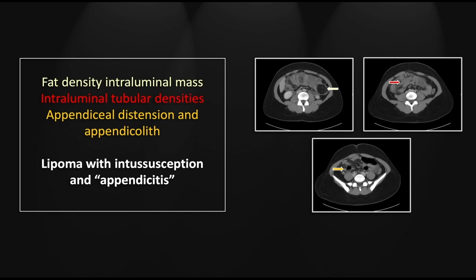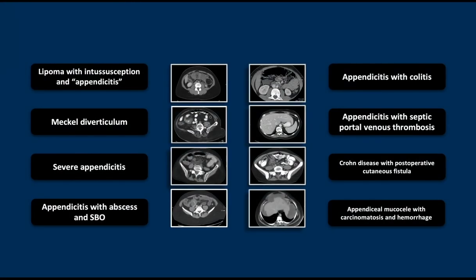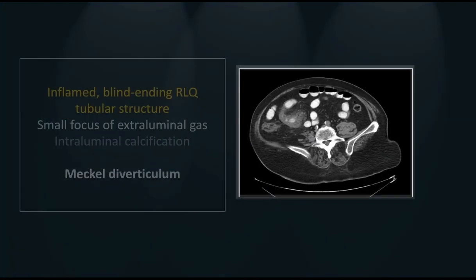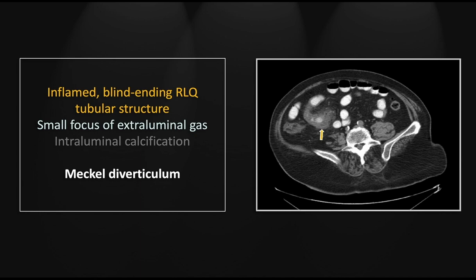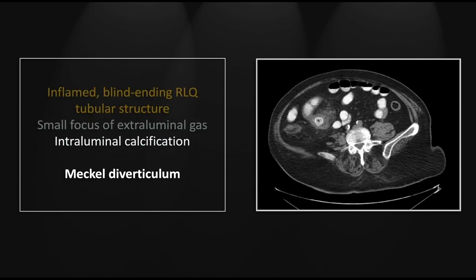Our next case is a Meckel diverticulum — the classic fooler. It's in much the same location as the appendix, but it comes off the terminal ileum. There is a blind-ending pouch demonstrating significant inflammatory stranding, and you can see a small focus of gas consistent with perforation. On the next image down, you can see a stone within that diverticulum, which is a common finding.